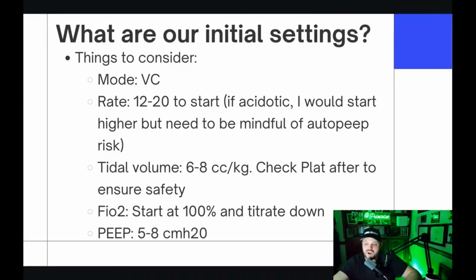Where I work now, where I've worked before, and even in residency, we break out the tape measure and measure people. I think that's what you should be doing if you're doing good ventilation, or doing it safely at least. When you're in the ED, it's different, right? Things are popping off, and it's hard to get the tape measure to measure the patient. I'm not saying you have to do that initially, but at some point you should get a height on the patient, just like you should get a weight on the patient, not when they roll in the ED you say, oh, it's probably 100 kgs, give me 100 of ketamine or something, right? We should be weighing these patients at one point, and getting a height on them.